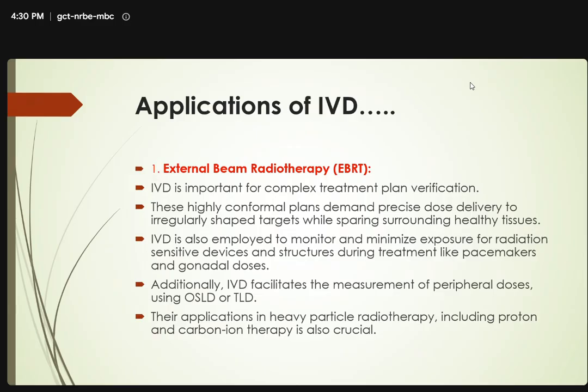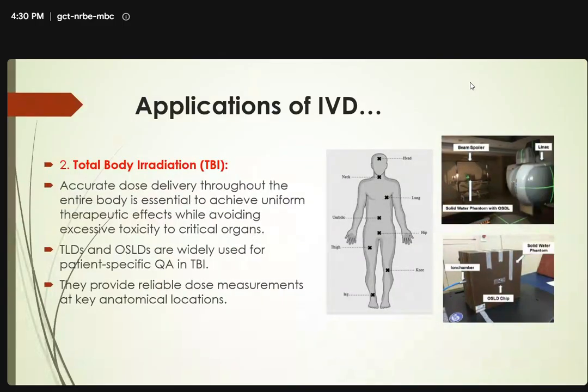Additionally, in vivo dosimetry facilitates the measurement of peripheral doses using OSLDs or TLDs. Their application in heavy particulate therapy, including proton and carbon ion therapy, is also very crucial. So, IVD has effectiveness and usefulness in EBRT. Second is application of IVD in total body irradiation, TBIs.